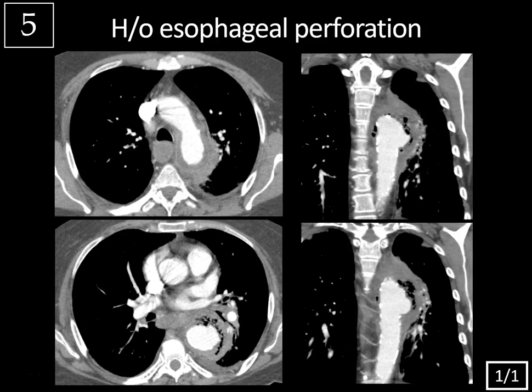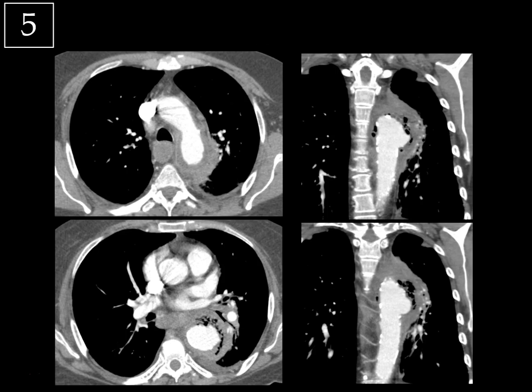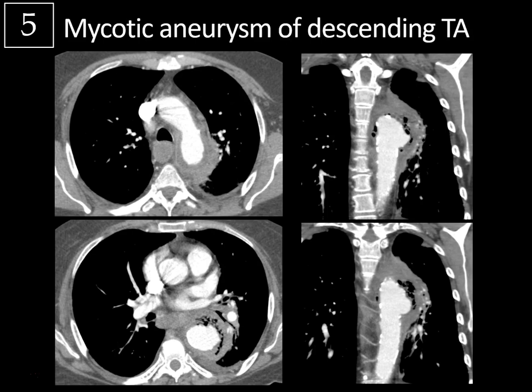Case 5: history of esophageal perforation, CT angiogram of the chest. At the aortic arch level, there's fluid and a hyperattenuating rim surrounding the descending thoracic aorta, indicating aortitis. Moving inferiorly, there's a saccular outpouching from the left aspect of the descending thoracic aorta surrounded by multiple foci of gas and a rind of soft tissue and fluid. The coronal images show this aneurysm is very saccular and irregular with a beaked appearance, surrounded by multiple foci of gas. This is typical for a mycotic aneurysm of the descending thoracic aorta.